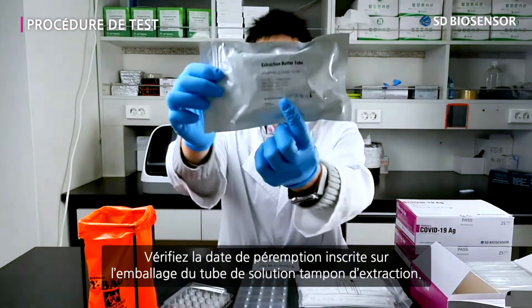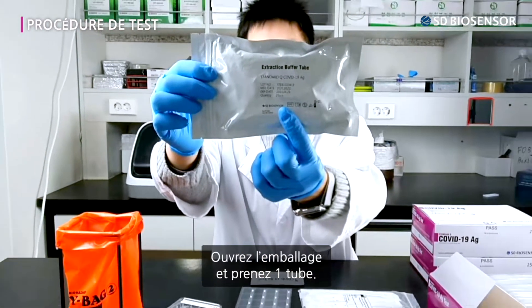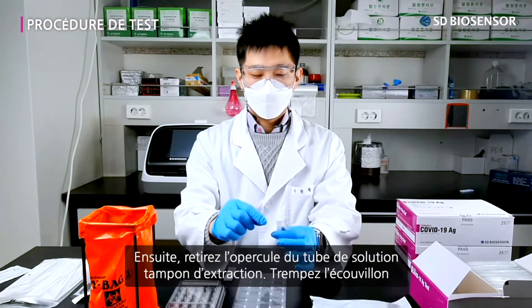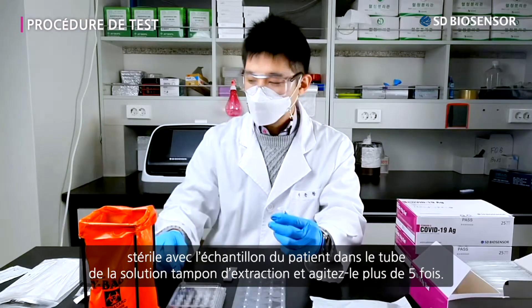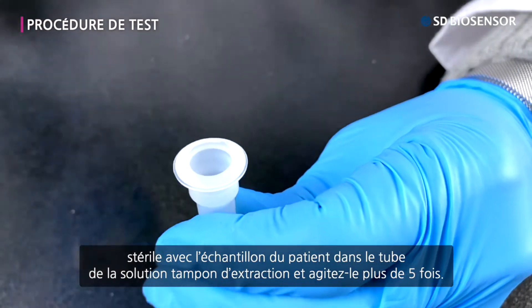Confirm the expiration date written on the wrapping paper of the extraction buffer tube. Undo the wrappings and take out one extraction buffer tube. Then detach the tube sealing of the extraction buffer. Dip the sterile swab with the patient's specimen into the extraction buffer tube and stir it more than five times.